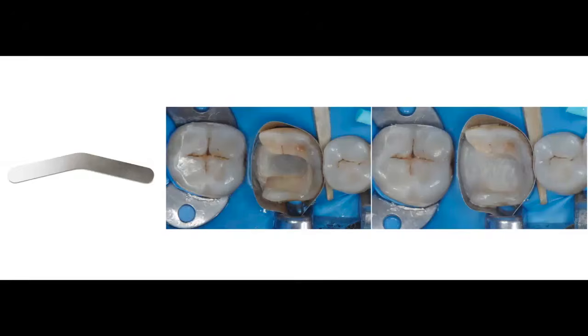So one of the things that you can use in order to elevate a deep margin, as we all know, is just a regular Tofflemire band. Now, these bands have their good and bads. The good thing is they're easy to acquire. You can buy them everywhere. They're not expensive at all. And if you're able to push this band apically, you will be able to elevate deep margins.